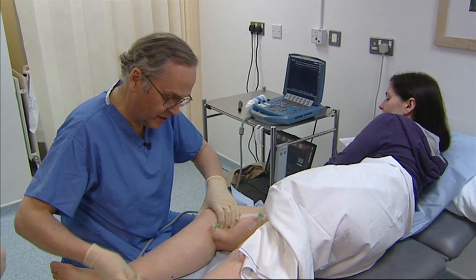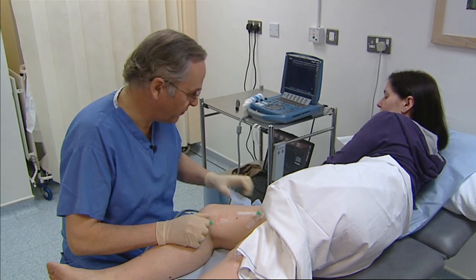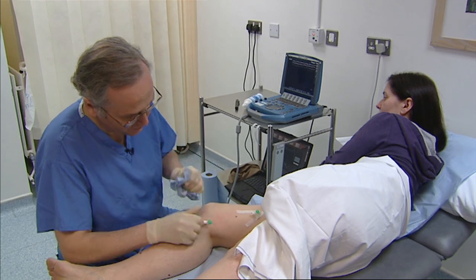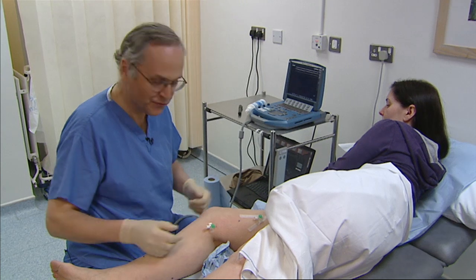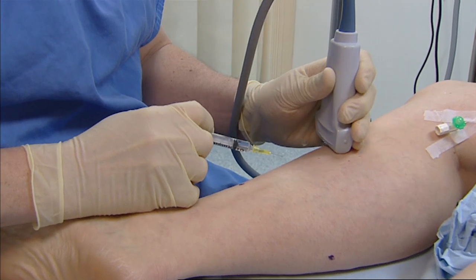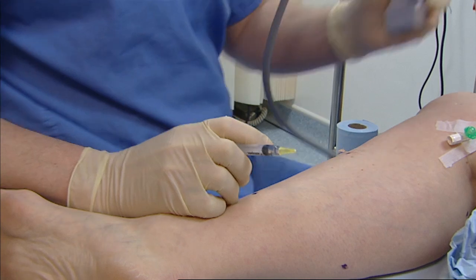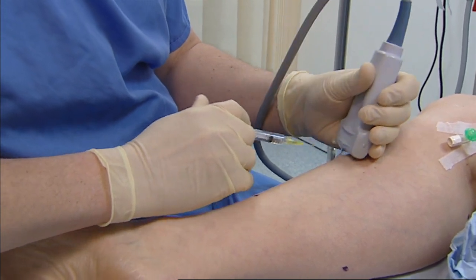The reason why we're putting several cannulas into the vein is that when we first started doing this, we used to only put one or two cannulas in the leg, but we found that gave incomplete treatment to the vein. So unfortunately now, on the receiving end, you get more injections. But on the other hand, the outcome is that more of the vein is destroyed, leading to a good long-term outcome.